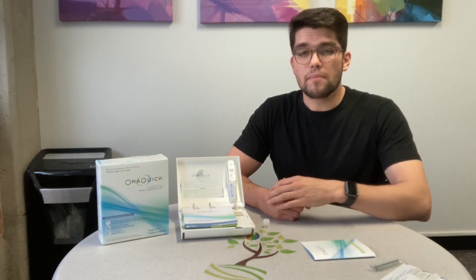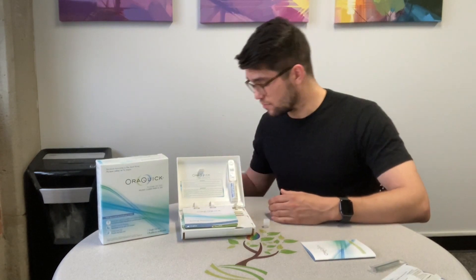And if you see no lines, or your test results don't look like any of the pictures included in your booklet, something may have gone wrong with your test and you need to start over with a new kit.